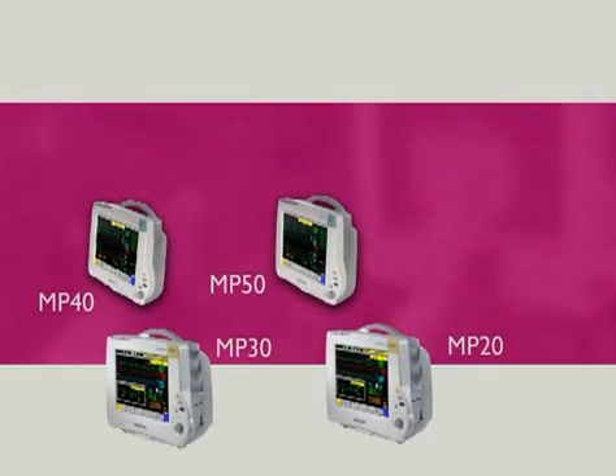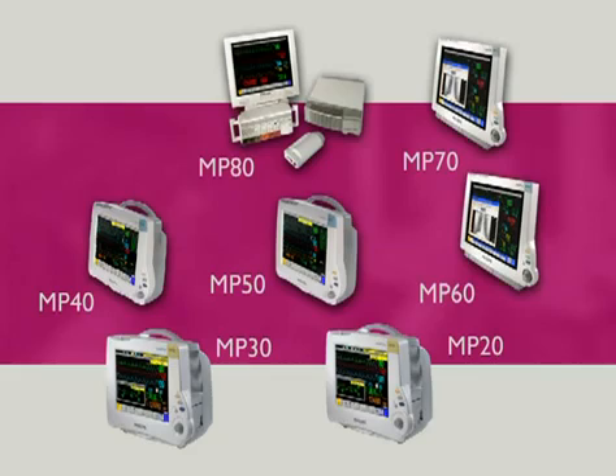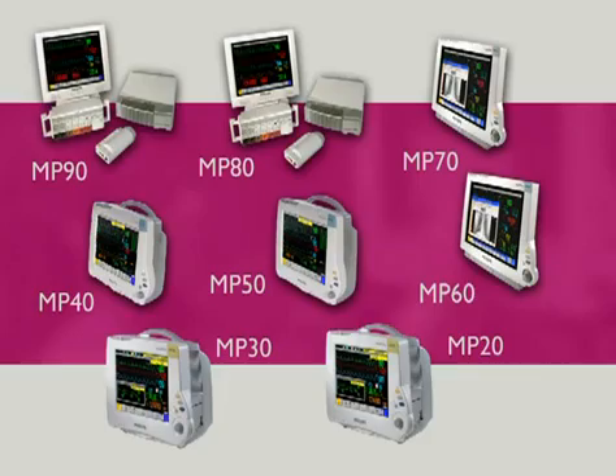IntelliView monitors include the portable MP20, MP30, MP40 and MP50, the versatile MP60, MP70 and MP80 for intermediate and acute care, and the MP90 with dual independent displays for the highest acuity patients.